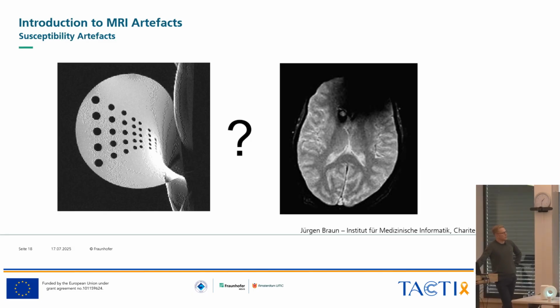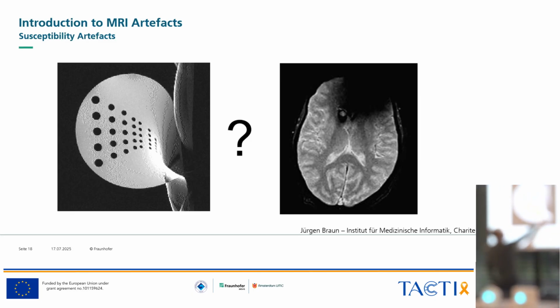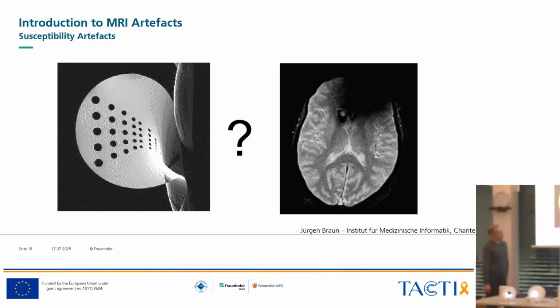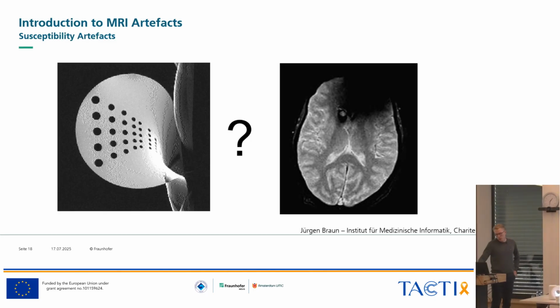And in that case, you will get, depending on your type of sequence, a really strong geometric distortion, as you see in here. So there we also have a combination of geometric distortion and this wraparound artifact, because they acquire such a large amount of additional phase. And here, for example, you have some sort of gradient echo-based sequence where this deviation from the main magnetic field results in a quite rapid loss of the spin coherence, so you won't measure any signal at all at that position.